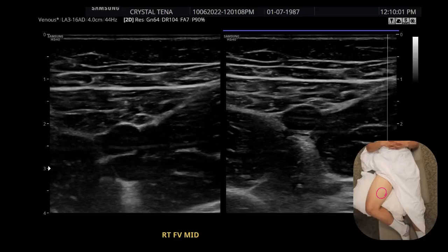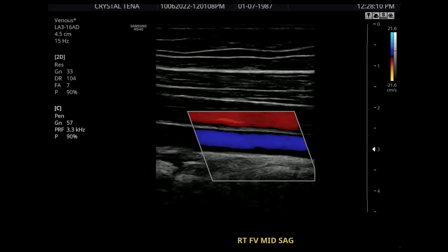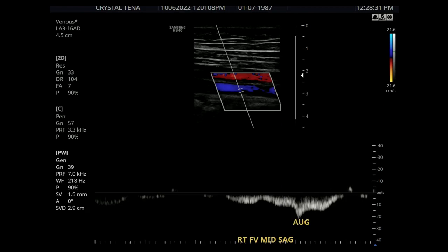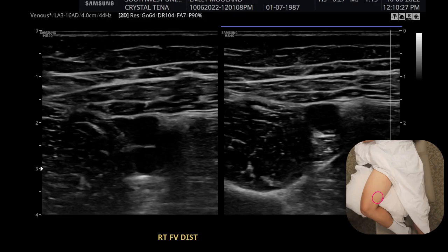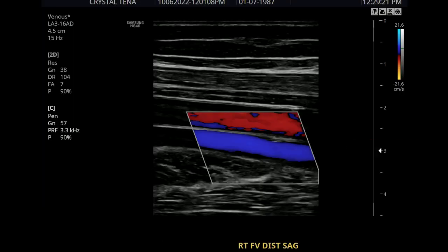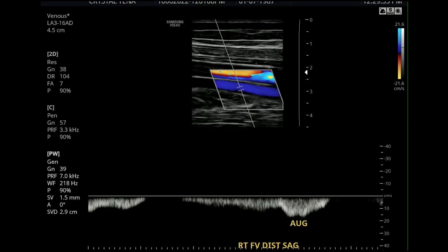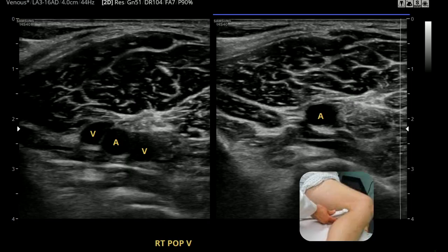Going further down the leg, you're going to hit femoral vein mid. This image is showing the femoral vein mid — the artery, which is in red, and the vein, which is in blue — along with the augmentation. After mid comes distal. Like in the previous images, you're going to want to have dual screen and show one without compression and one with compression. This image is showing both artery and vein, and again you're going to do the augmentation for the femoral vein distal.